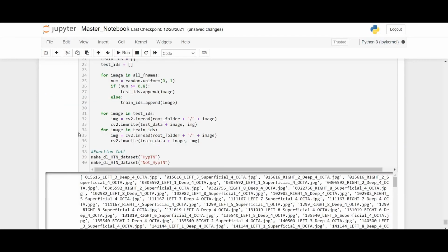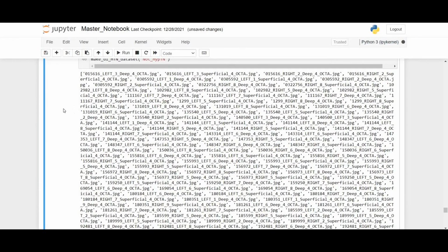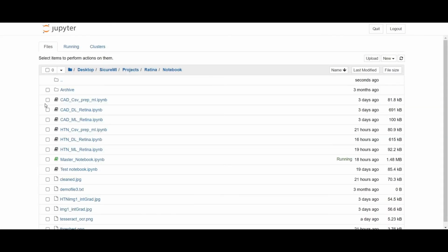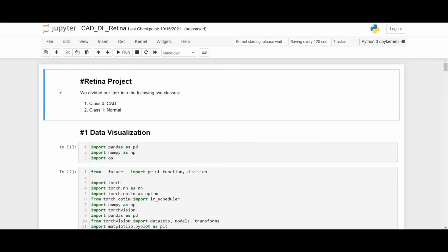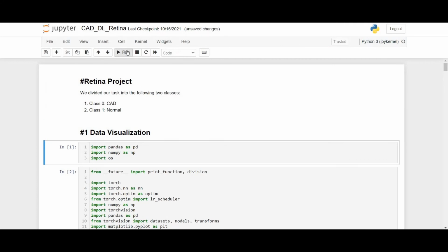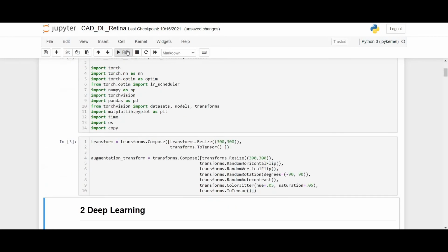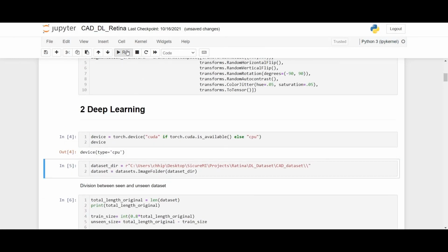Now the data has been split into training and testing datasets, we can train the deep learning model. To train the deep learning model we are going to run code in the htn_dl_retina notebook. For deep learning, we have used PyTorch, which is an open source AI library based on the Torch library, used for applications such as computer vision, deep learning and natural language processing.